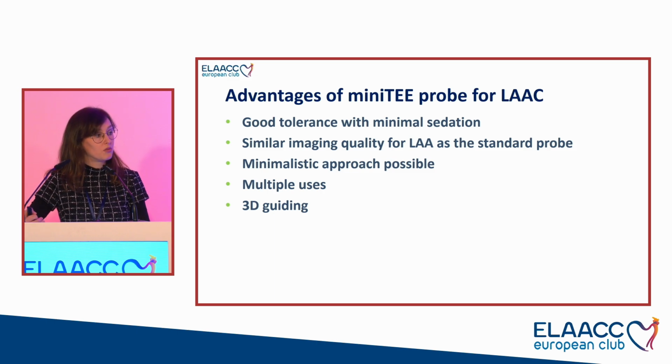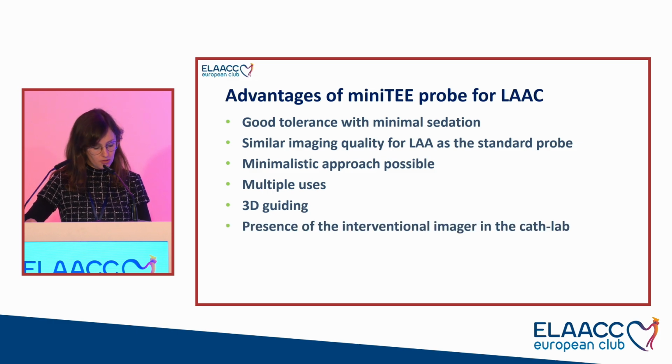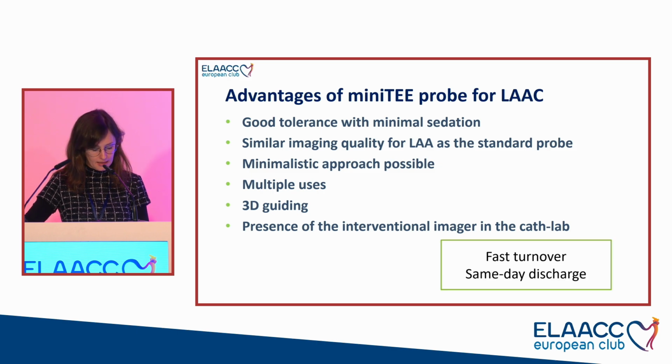Also, it allows you to do 3D guiding, which will be the second part of my talk, that I think is super important during left atrial appendage closure. And this point I just added, that it's also nice to have an imager in your cath lab, because we can add value regarding the echo and the anatomy, and it's always nice to be a team in the cath lab. So with these probes, we can do a fast turnover and same-day discharge.